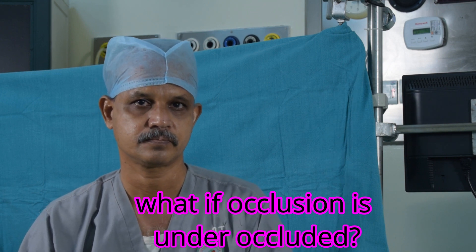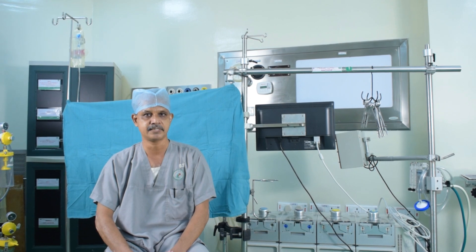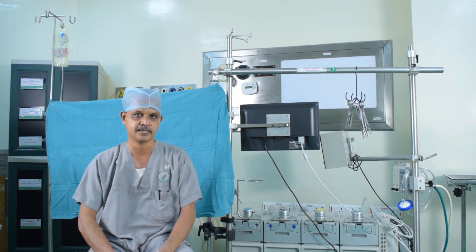What will happen if the occlusion is not right — say it is under-occlusion? If under-occlusion occurs, there will not be adequate forward flow. The pump display will be overestimating — meaning the flow numbers you see are not corresponding to the actual flows going into the body. For example, if the display shows 4 liters per minute, the patient may only be getting 3 liters.